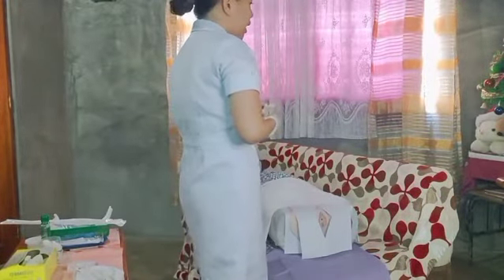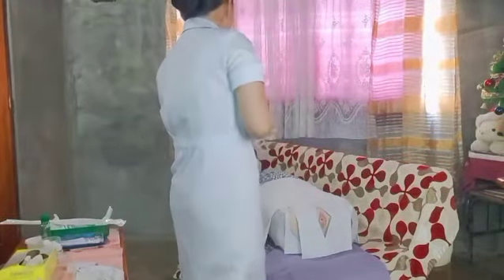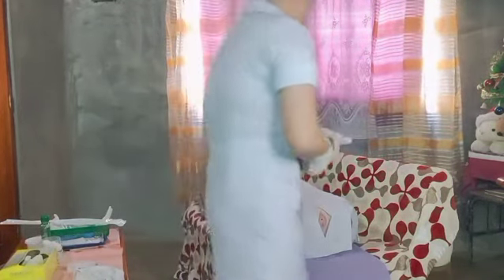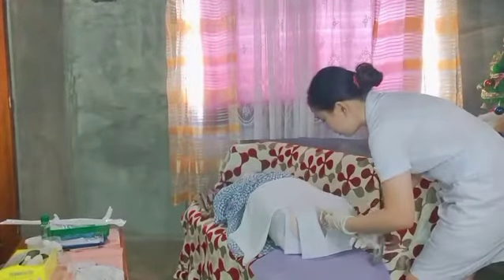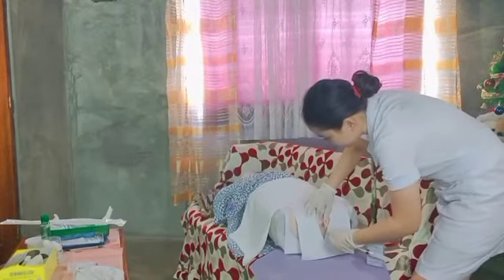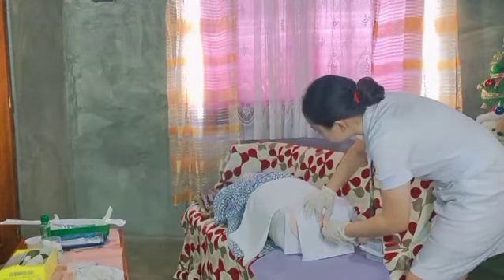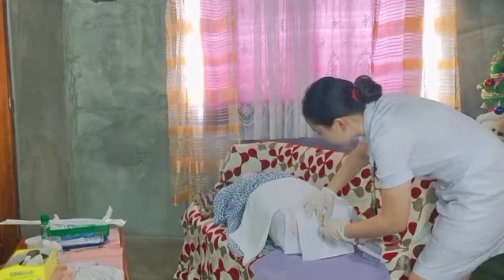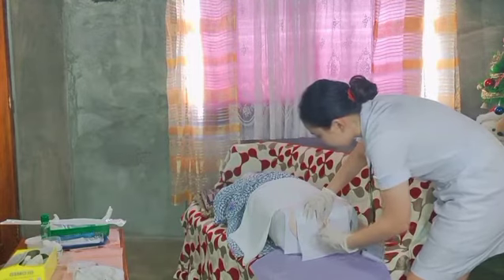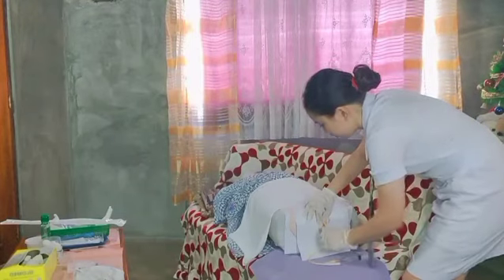Hinga po tayo ng malalim. I-insert ko na po sa inyo. Okay po. Sabihan niyo po ako, ma'am, kapag nakaramdam po kayo ng any pain or irritation po. So, ulit lang po, ma'am. Hinga po kayo ng malalim. Okay po. Masakit po ba, ma'am? Isa pa po, ma'am. Hinga po malalim. Okay. Isa pa po, ma'am.